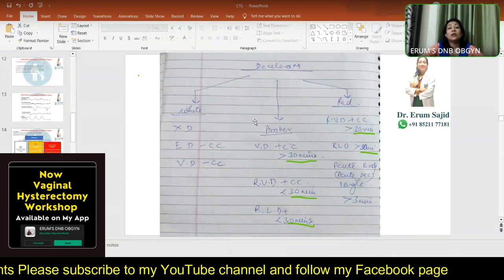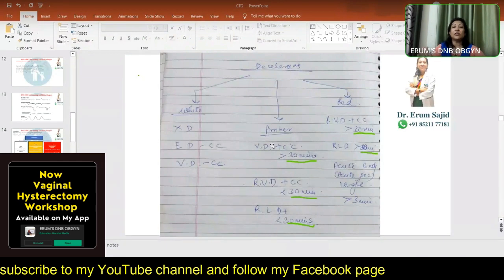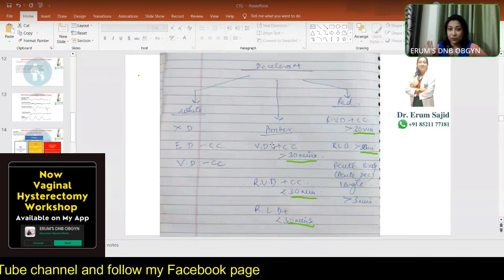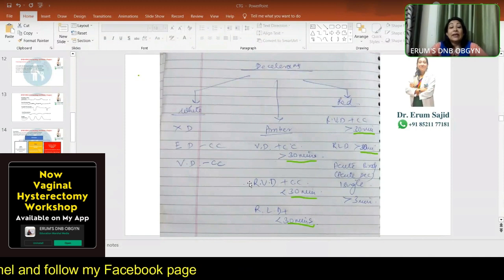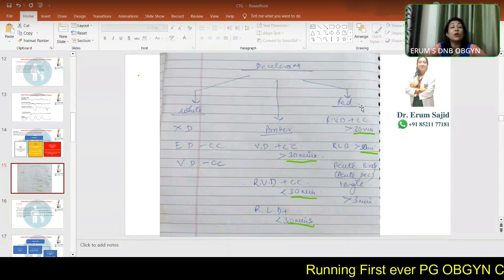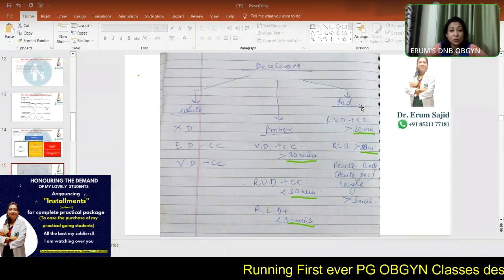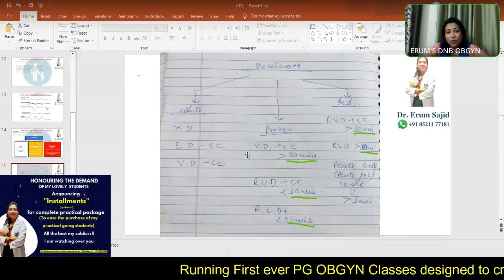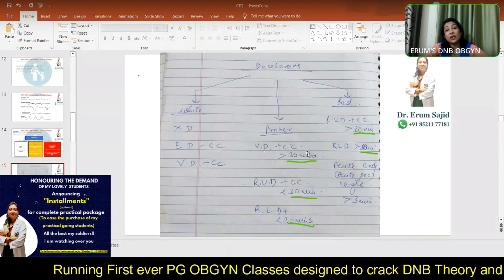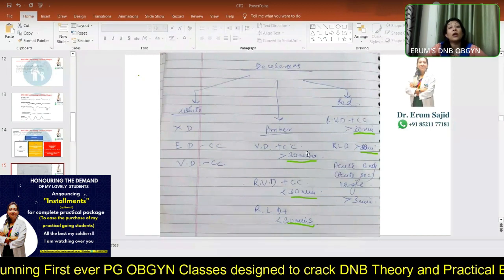Okay. So till 30 minutes, you were still sitting over it, even with concerning characteristics. Right? That means you never informed your specialist, to be very honest. So that's the idea about this white, amber, red. Where are we going with these? This is what I'm going to tell you in the slides to come. So variable decelerations with concerning characteristics, now they started happening, and you're waiting for the 30 minute mark to announce to your superior.